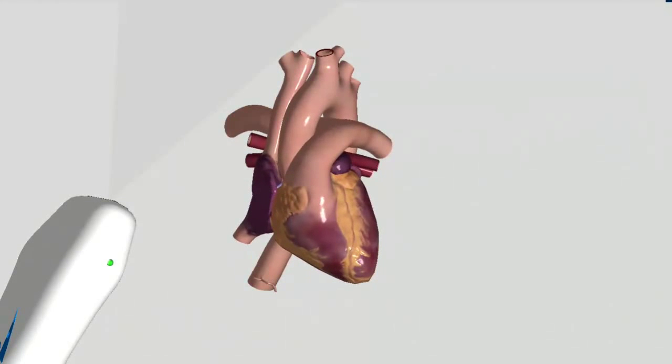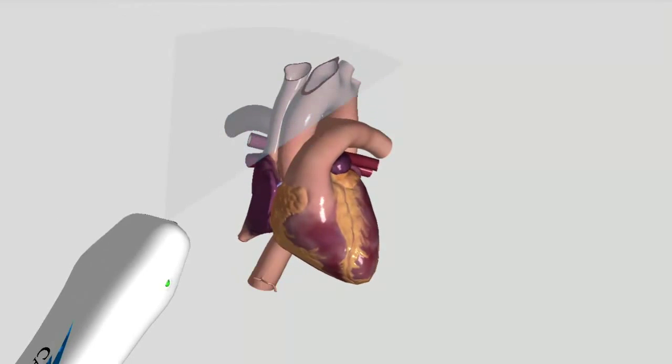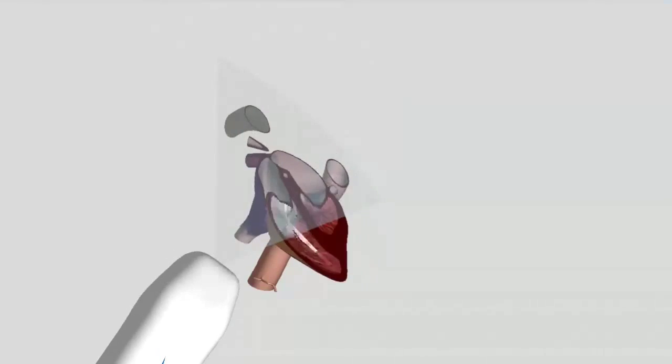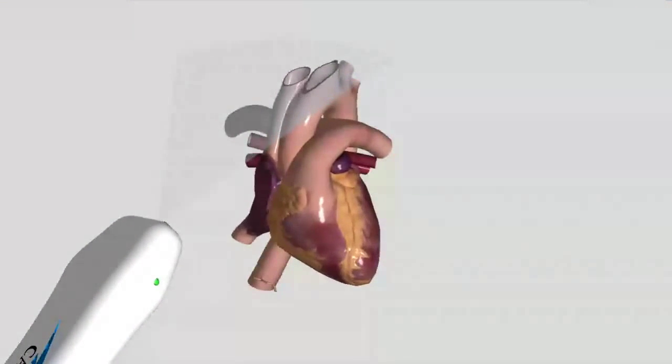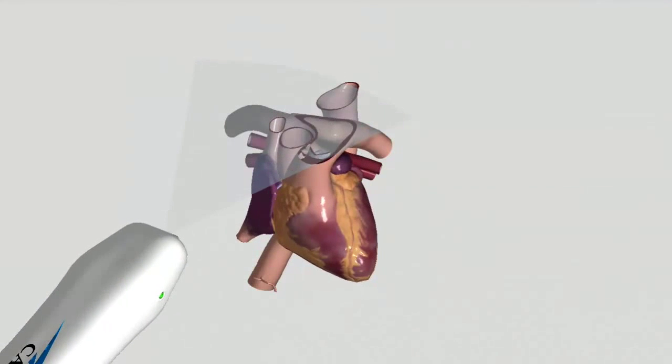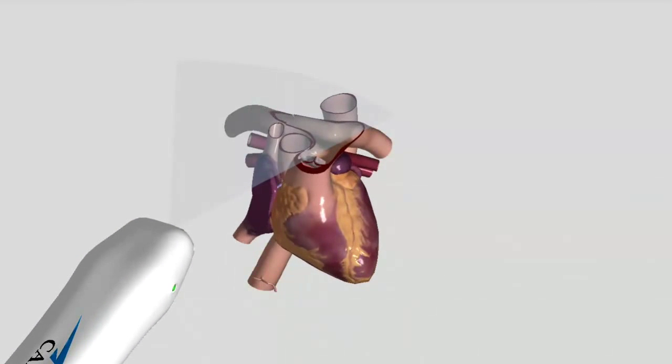This is going to be a walkthrough of basic cardiac anatomy using the CAE VIMEDIX ultrasound simulator. I'm going to use this simulated ultrasound wand on the left that is normally used to learn ultrasound techniques, except here instead we'll be using it to explore the anatomy of the 3D heart model. What we'll do is simply follow the path of the blood through the heart and discuss the major anatomical features that we see, and also explain just a little bit of their function.